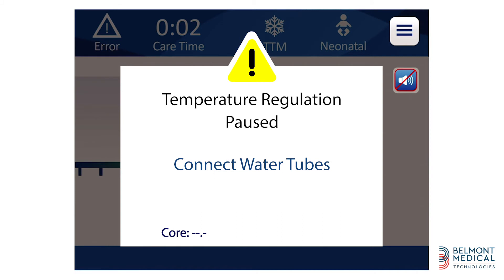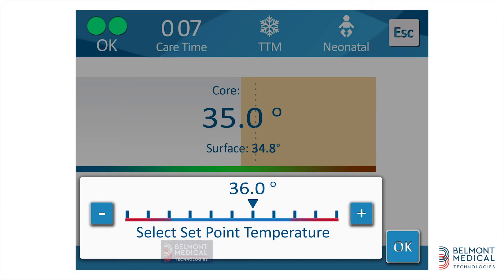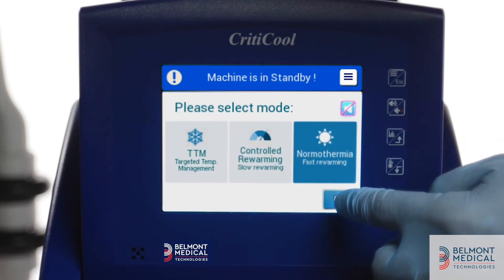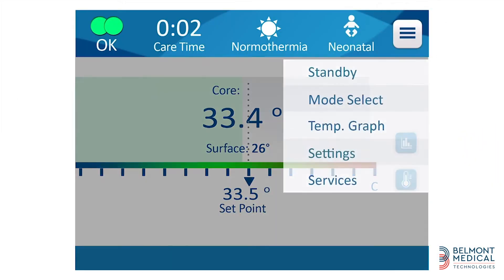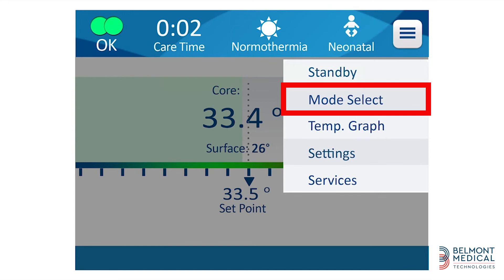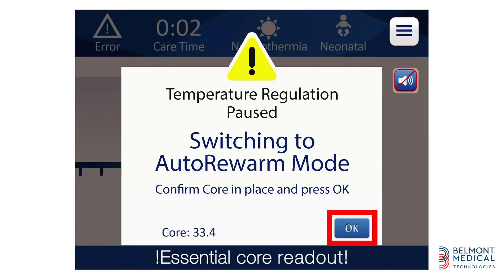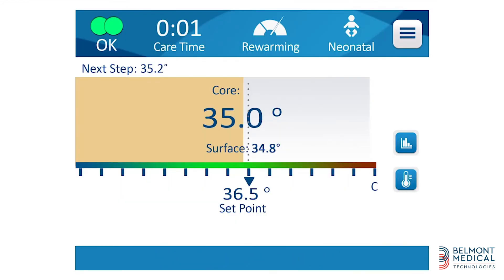The system is designed to maintain the set temperature for as long as needed. The system also offers protocols for controlled rewarming and normothermia. Touch the menu icon and in the mode select option, touch controlled rewarming. A confirmation of the core readout temperature is essential to activate the rewarming mode. Once accepting the change, the status will be changed and you will be able to see that you are in rewarming mode.